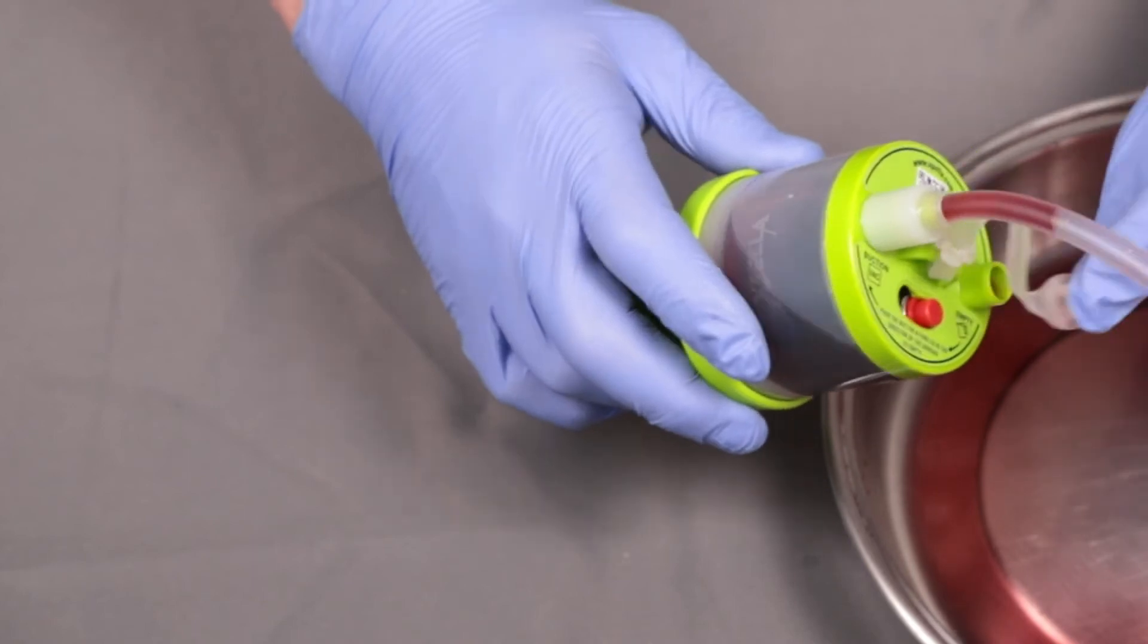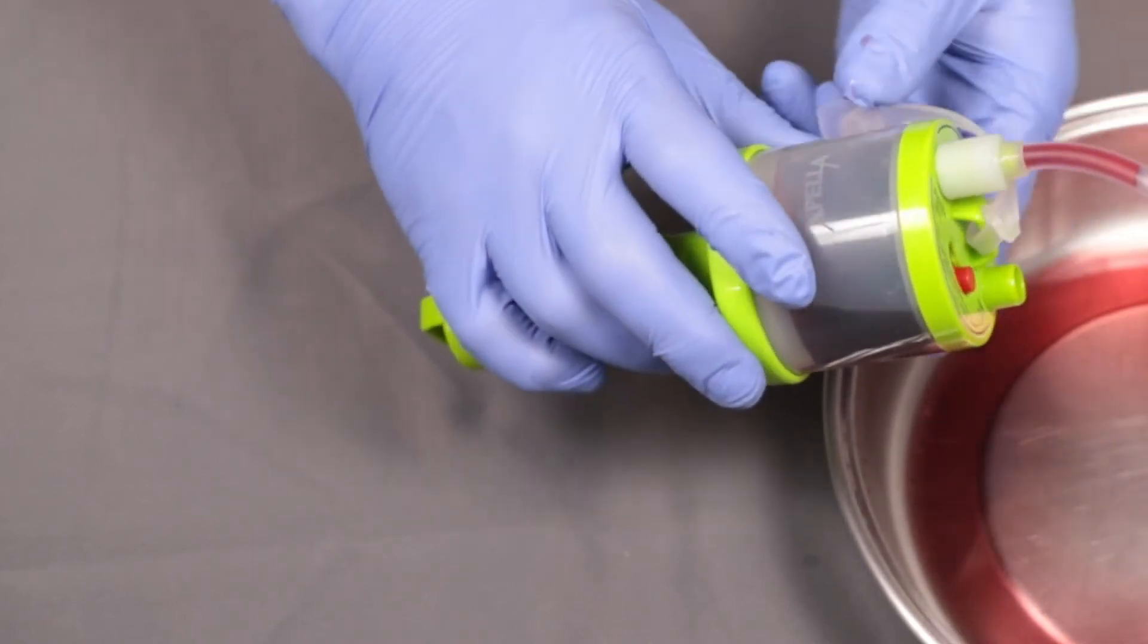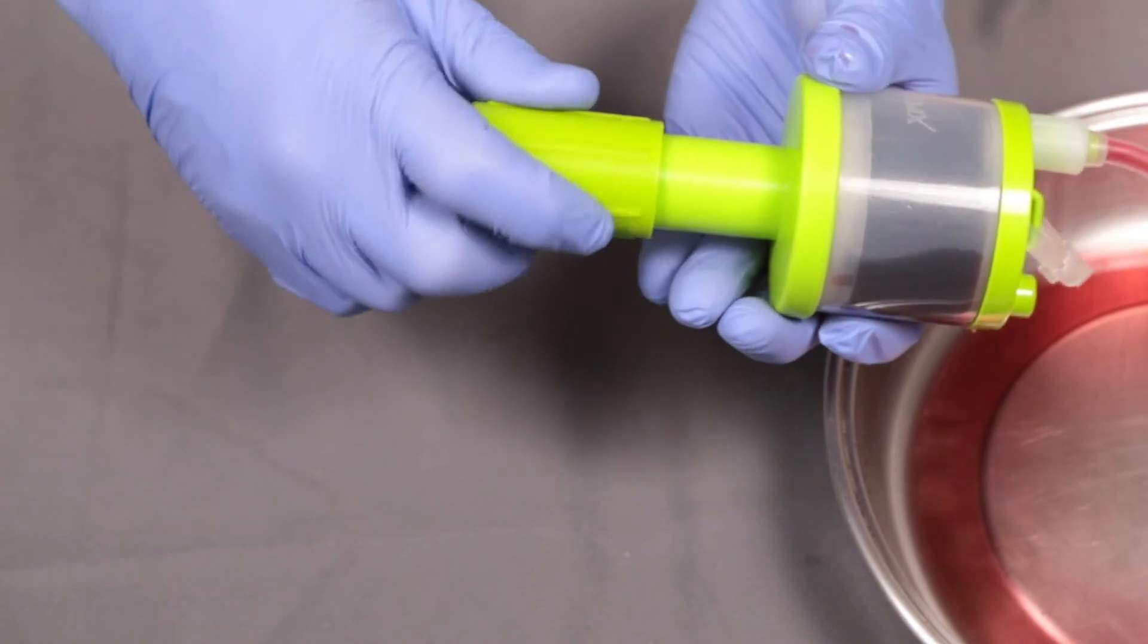Open the plug. Screw the handle towards the reservoir expelling the exudate from the device.